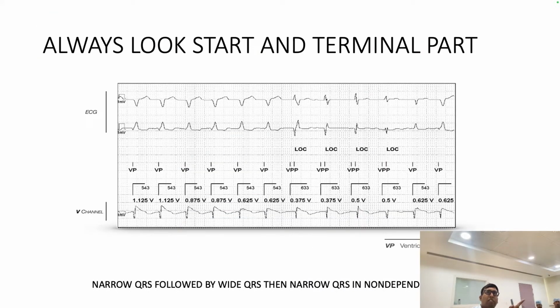So always look at the start and end part, and wherever pacing is happening, the patient is complaining of palpitation because he is doing fine and all of a sudden the heart rate goes up, so he is feeling palpitation. So this was the reason. And whenever the question is framed, the typical normal pulse and then capture, you will say malfunction is happening. Why? What Anand was saying, the LV lead threshold is being checked, and people think something is wrong.